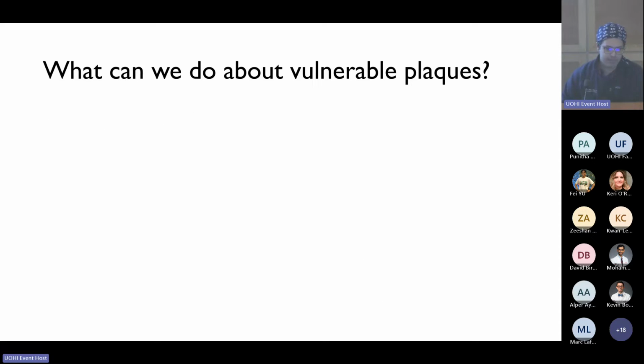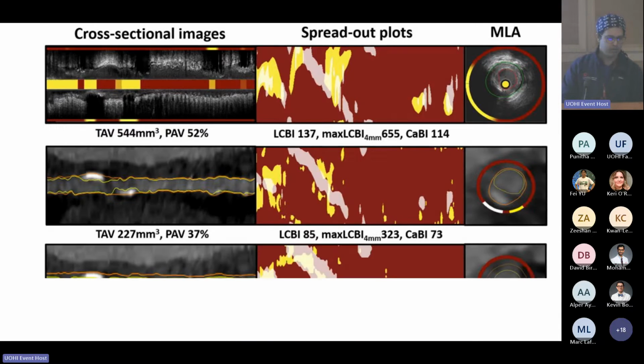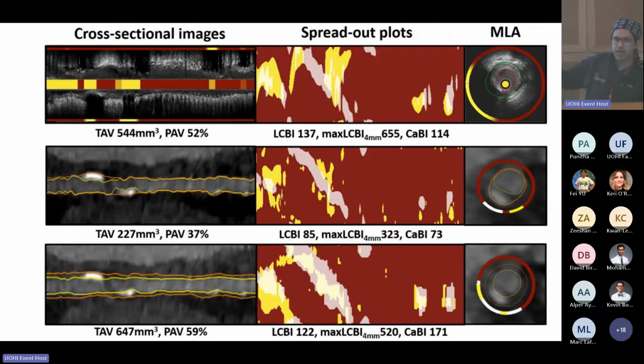So for intracoronary imaging, invasive imaging, I don't understand how you actually quantify, let's say, the macrophage burden. How is it done? Well, so there's different ways.